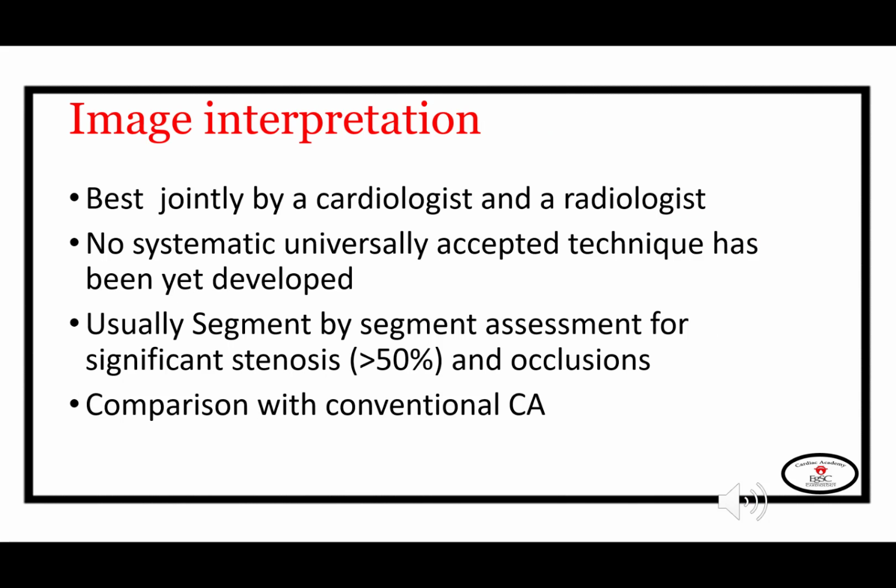To interpret the image, it is better to start the learning curve by combining a team of cardiologists and radiologists to gain experience in both fields. There is no systematic universally accepted approach developed. However, we should go systematic segment by segment of the different coronary arteries for the presence of significant stenosis or occlusions, and it is better in the early part of the learning curve to compare with conventional coronary angio to increase the experience.